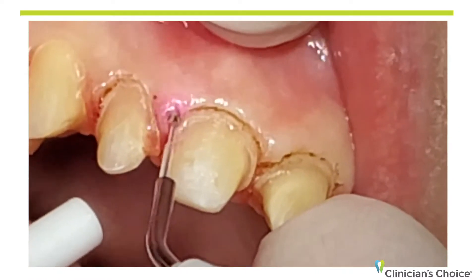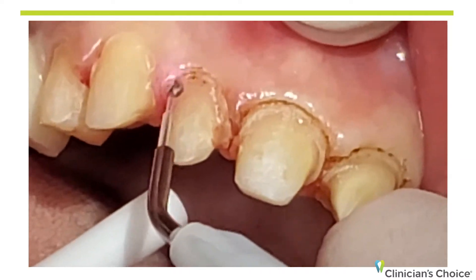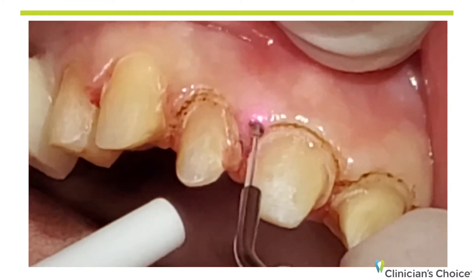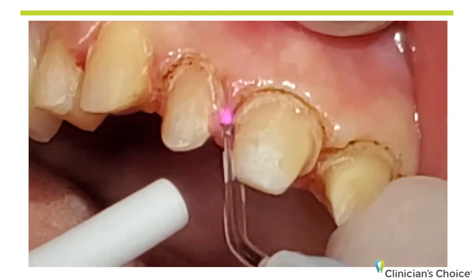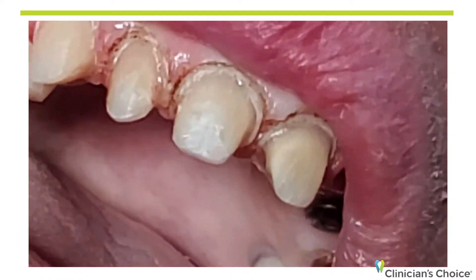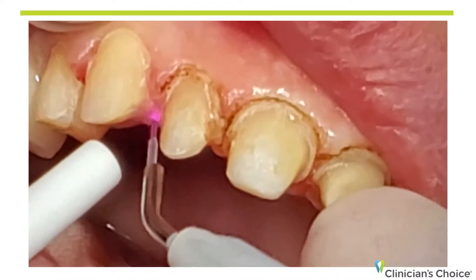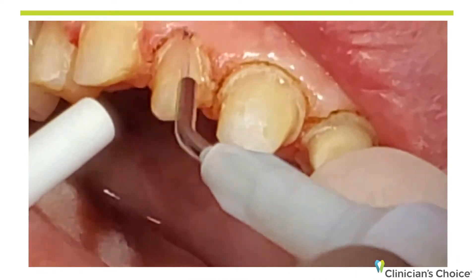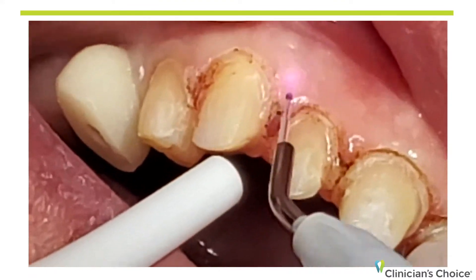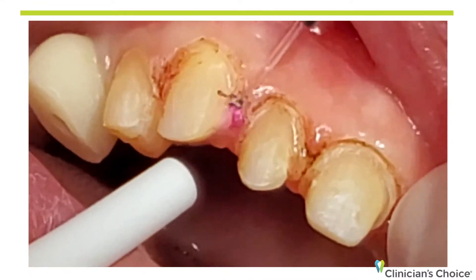If you do get a little bleeding, it means you have just an inflamed area and it'll stop in a few seconds, or of course we could use Tissue Goo if need be. Keep in mind that with diodes, the energy comes out the end of the tip, not the side of the tip. So you always have to point the tip in the direction that you want to remove the soft tissue. I do sometimes leave tissue on the tip to act as a heat sink — it cuts a little bit faster. Here I have an inflamed papilla, so all I'm going to do is angle that laser towards the papilla and just plane it down.